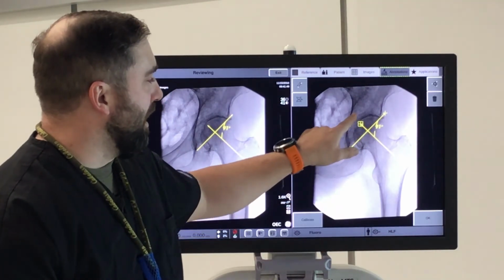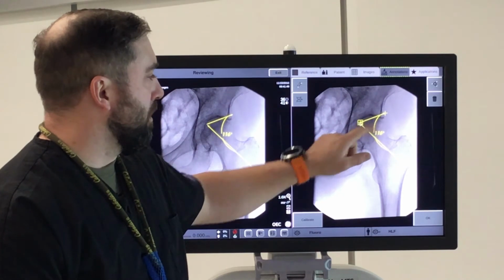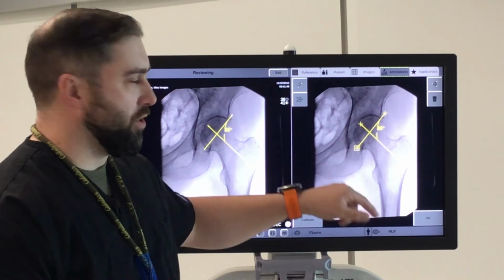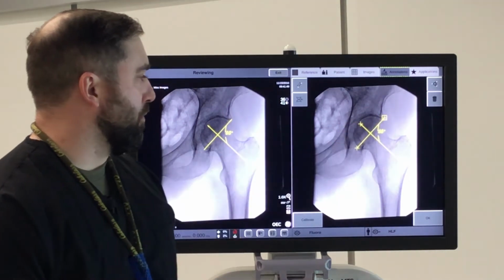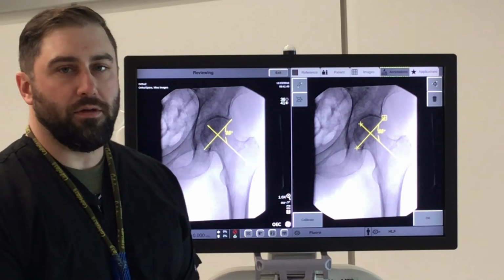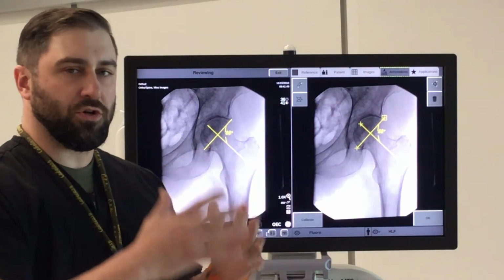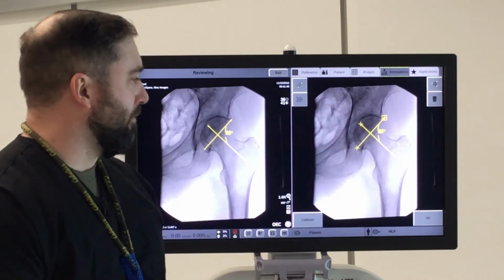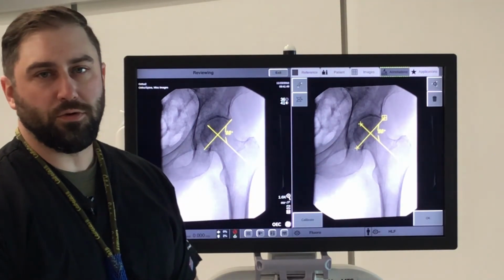And what's nice is they don't have to touch, so I don't have to measure them like this. I can actually put these two lines in separate places, so I can measure the angle difference between two separate things. This will also work very well if you're trying to measure the total pelvis and you're trying to make sure that the angle of the hips is still in the correct orientation. A lot of different things you can do with this angle measurement tool.